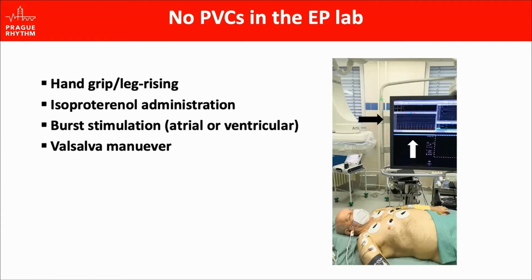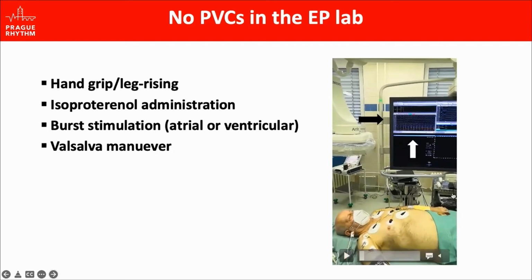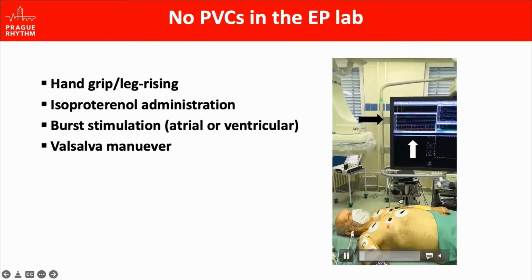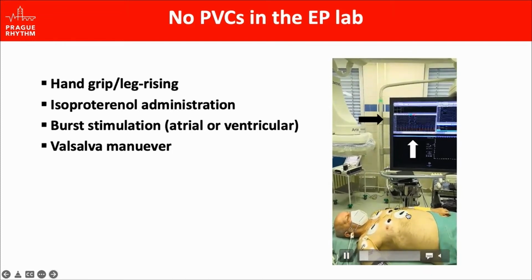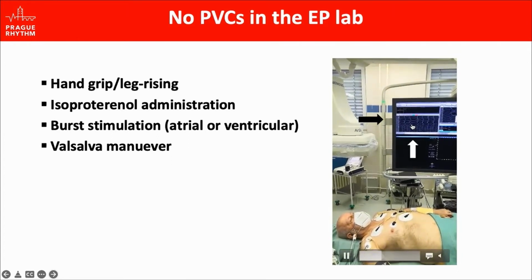And for the sake of curiosity, I'm going to show you a video from our EP lab. This is a patient with frequent PVCs in real life, but no PVCs in the EP lab. And this can be really frustrating. In this patient, we asked him to take a deep breath to perform a Valsalva, and all of a sudden there was a PVC bigeminy, as you can see. Now the patient is breathing normally, and the PVCs are gone.